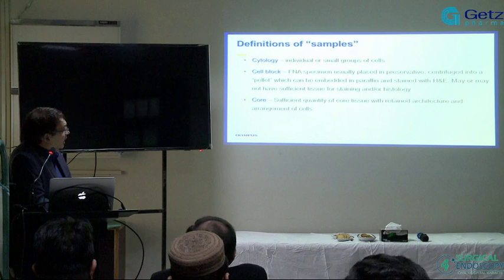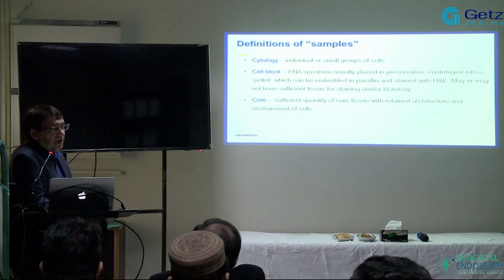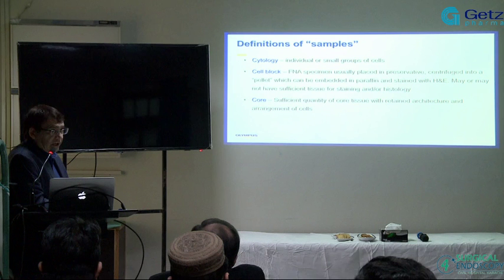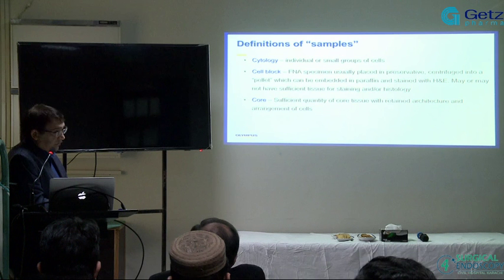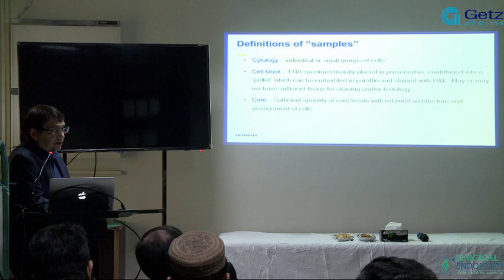So that is the main tissue which they can save for later use as well for immunostaining, or if they've got to send the slides somewhere else. They can send that for a second opinion. If they've got to do some other studies on that, they can do that.